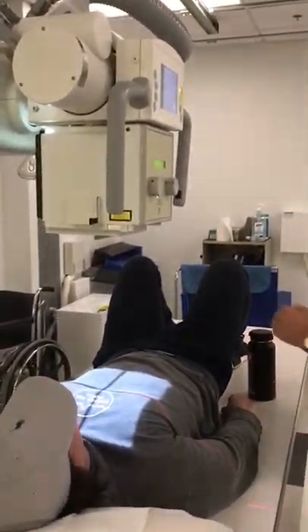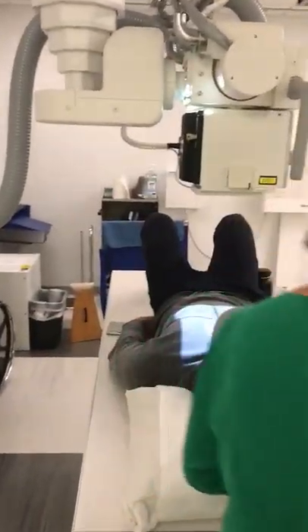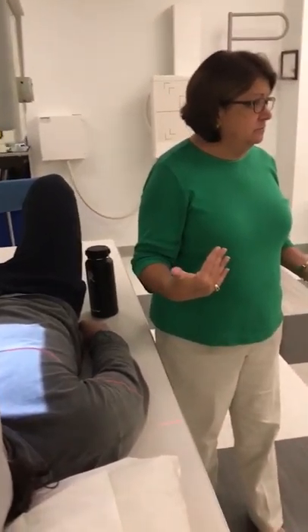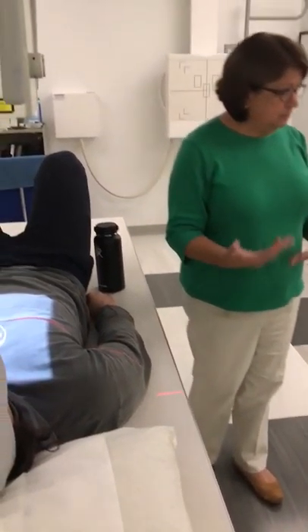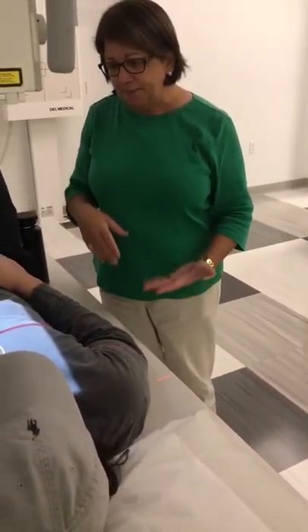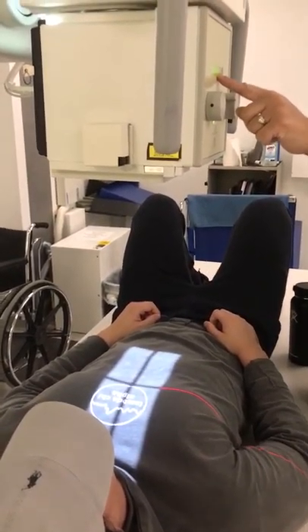Okay. So for the AP, we're centering in midline. We want to make sure that our patient is straight on the table, all the way down and centered on the table. We already centered at T6, basically, when we made sure that the IR was 2 inches above the top of the shoulders. But you should know that we're measuring at T6, which is about 3 inches below the jugular notch. So you don't have to center up and down now. For the AP, just make sure that you're centered in midline. And we collimate to 6 inches. And you know it's 6 inches because of the readout. It says cross six. That's 6 inches across.